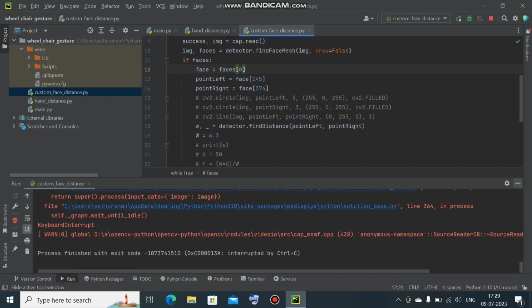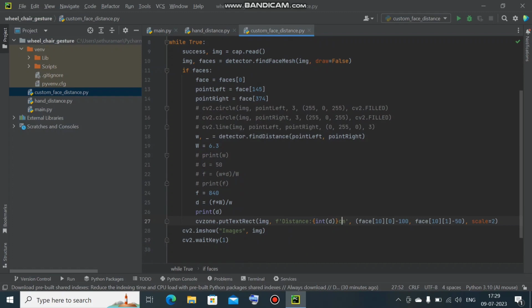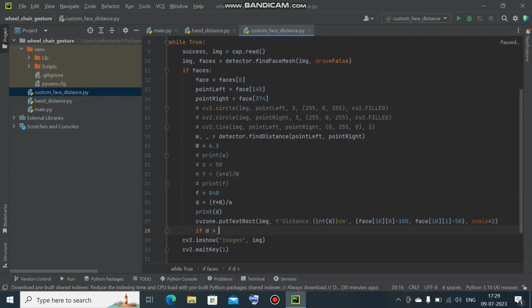Now as the next step, if you want to make a robot autonomous using this distance, you can simply use this distance variable in an if statement. This is only with software, not with hardware. If you need to do this with hardware, like Raspberry Pi or Arduino, you need to change the code. If D is greater than 75, let us say 75, if my distance from the camera is greater than 75, I'm printing robot is moving forward.